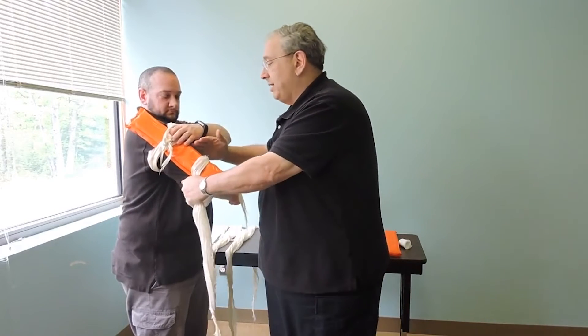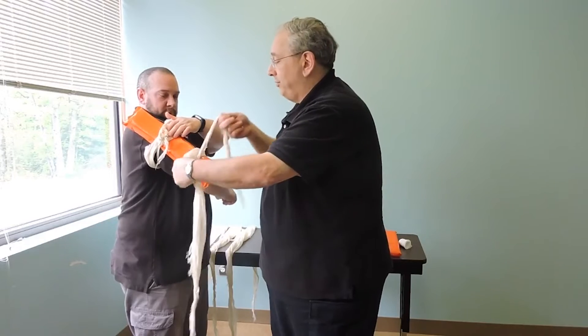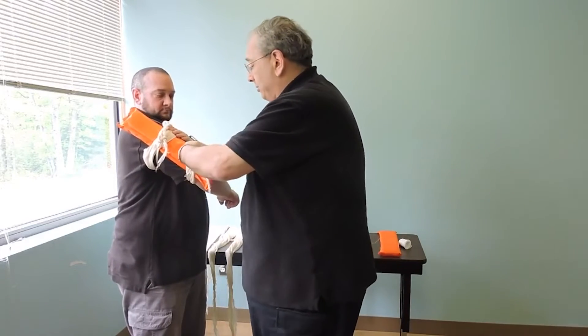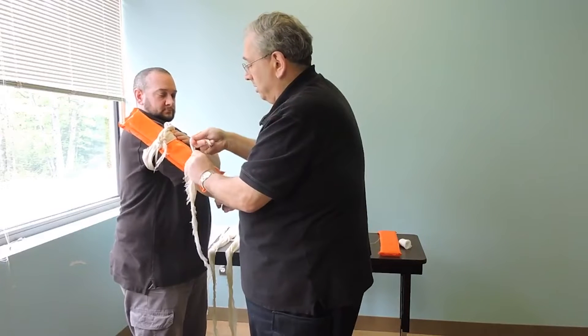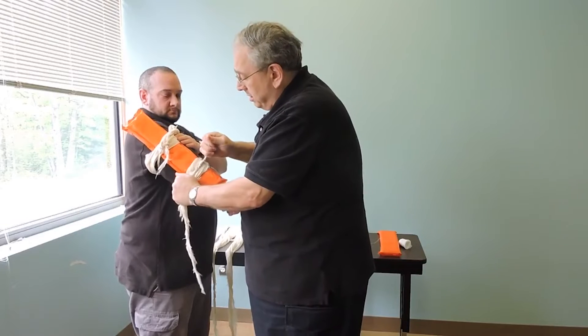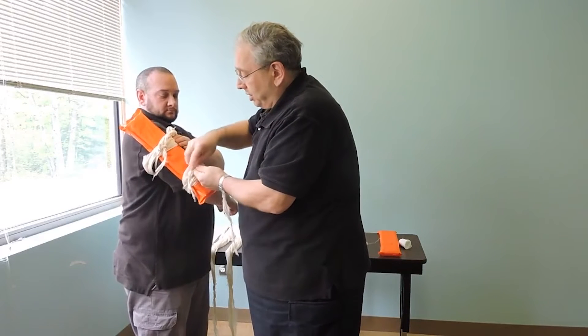The next one comes down here by the elbow. The break is here — I'm not touching, I'm not putting any pressure on that site of the injury. Tie it around twice, loop it around again with the surgeon's knot and secure it.